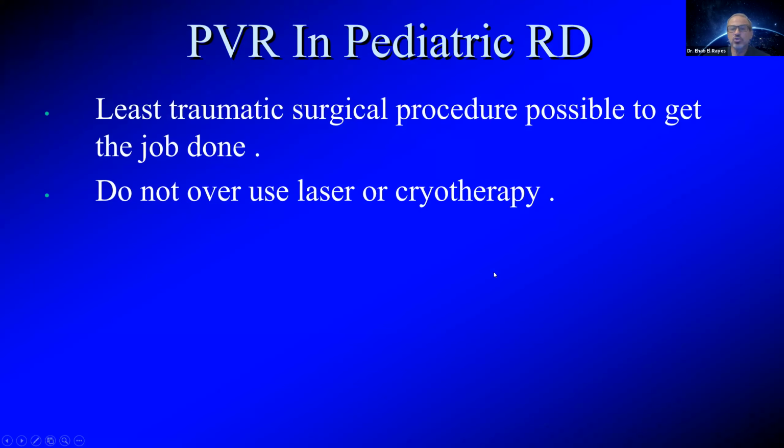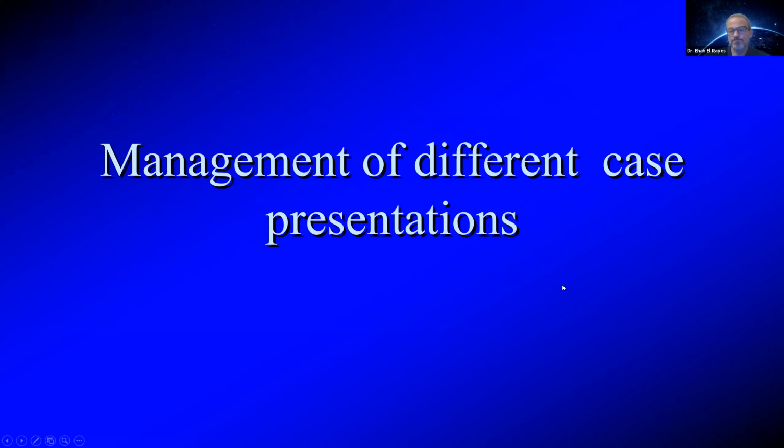And doing the least traumatic surgical procedure is very important, with the least amount of breakdown of the blood-ocular barrier, like laser and cryo. So if you can avoid putting too much laser, then that's definitely a good point. That's my first part of my presentation.